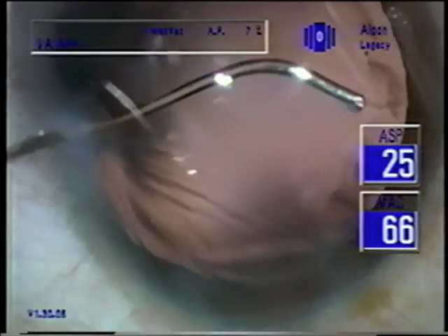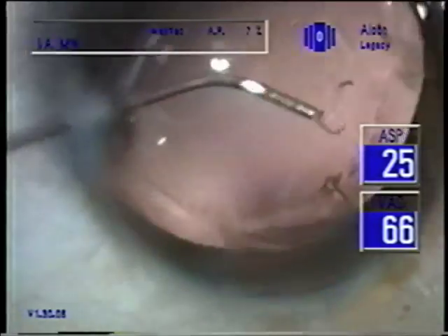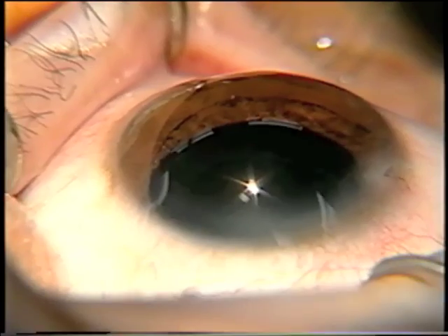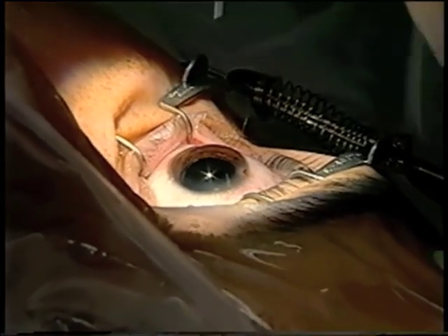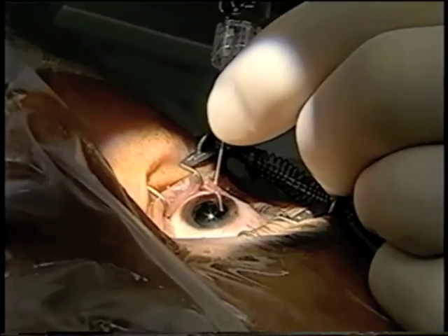Howard, someone asked if a 0.2 might be more useful than a 0.3 for these small strands with the I-A. Yes, it would be. But that is efficient when you want to get thicker epinucleus out. So that's a trade-off.